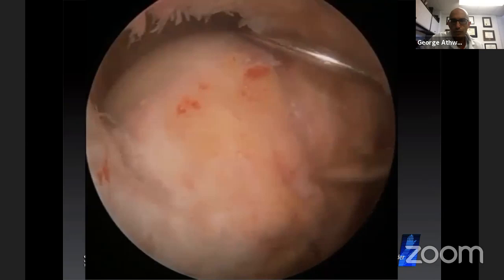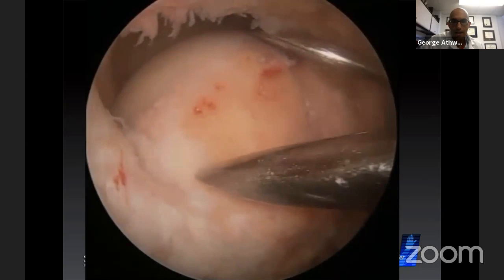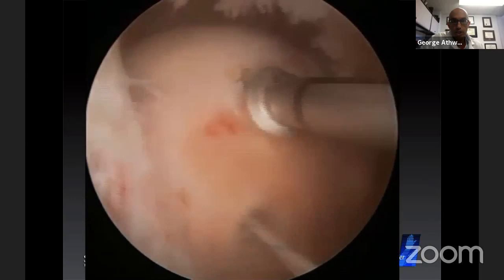I'm going to place an anchor here, one there. So I'll show that again. So there's the biceps groove. One anchor here, one there. And then we're going to do a double row transosseous equivalent with two anchors in the biceps groove. So I like to use metal anchors as much as I can because they're a little bit more cost effective. So I'll put two anchors into the medial aspect of the lesser tuberosity.